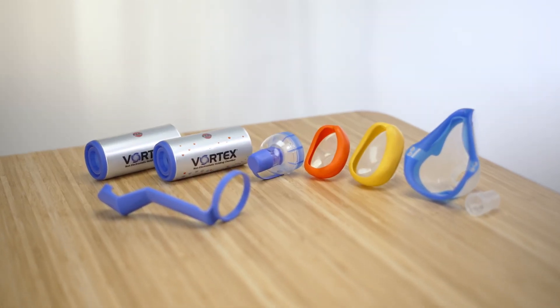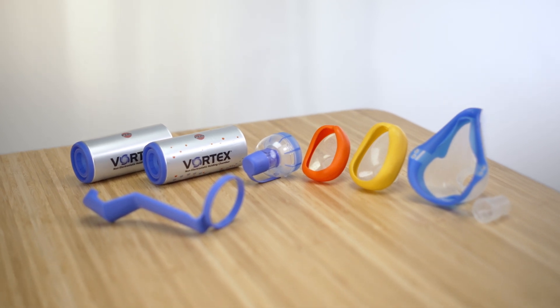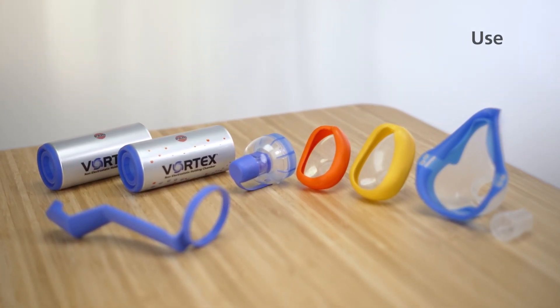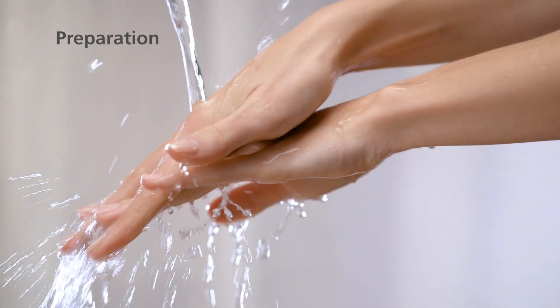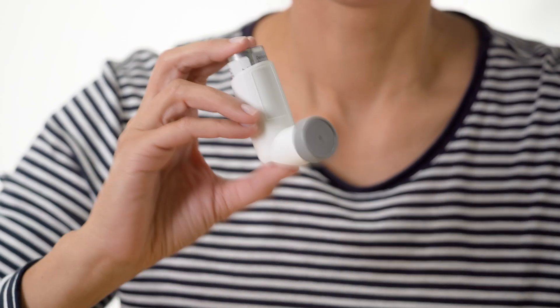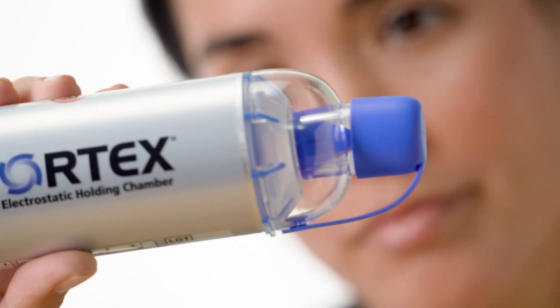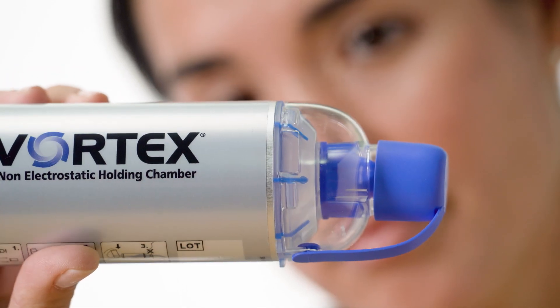To ensure reliable metering and very good aerosol performance, we recommend the following steps. Wash your hands thoroughly before each inhalation session. Shake the metered dose inhaler and pull off the cap. Check that there are no foreign bodies on or in the holding chamber and ensure that the valve is closed.